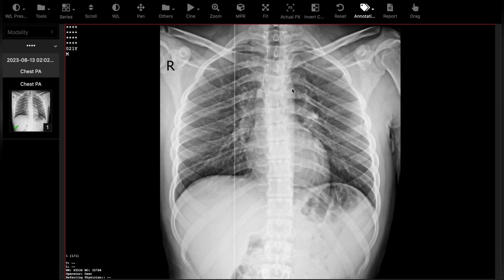Now look at here. The lung parenchyma is normal and you can see the costal part of the parietal pleura vividly. If the parietal pleura gets separated from the chest wall, the air will accumulate in this space, and this is where pneumothorax occurs.